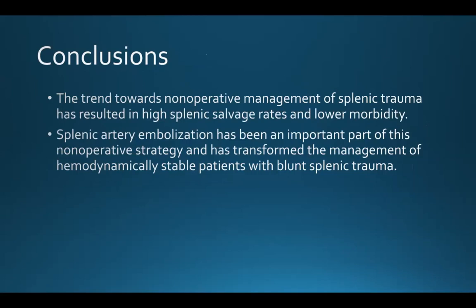So in conclusion, the trend towards non-operative management of splenic trauma has resulted in high splenic salvage rates and lower morbidity. Splenic artery embolization has been an important part of this non-operative strategy and has transformed the management of hemodynamically stable patients with blunt splenic trauma.